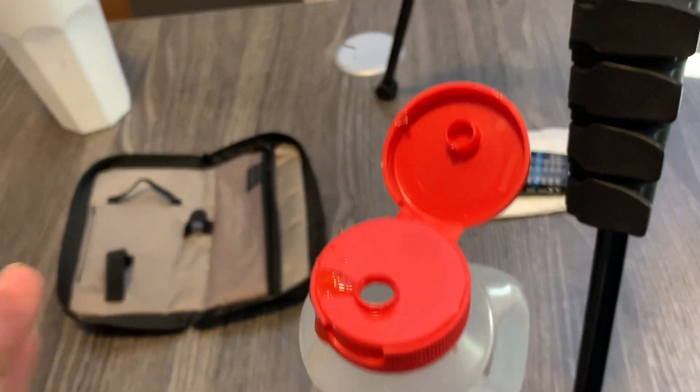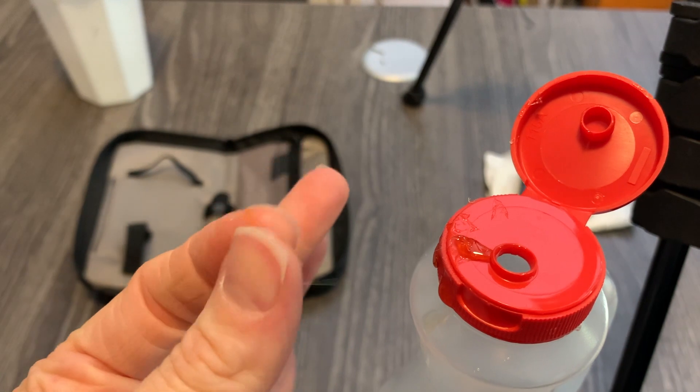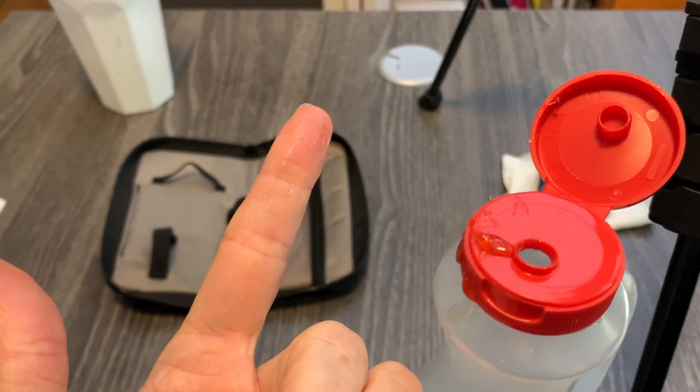I wanted to add on to this video with a little demonstration. Sometimes patients' hands are not really clean when we do a test, so I want to see if that actually impacts the reading. I have a little syrup here — I'm going to put it on my finger, let it dry, and come back and test it. Okay, there's just enough syrup on my finger now — it's all tacky. Let that dry and we'll come back in a minute.